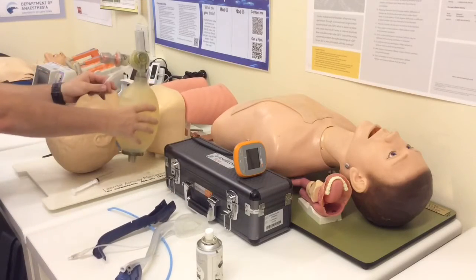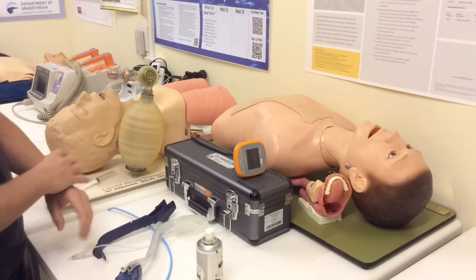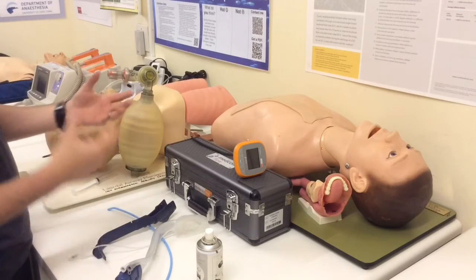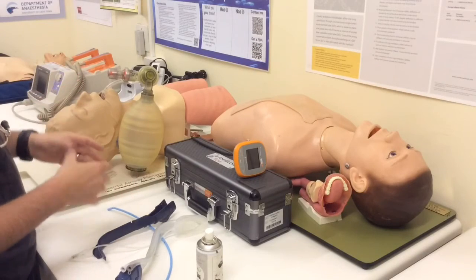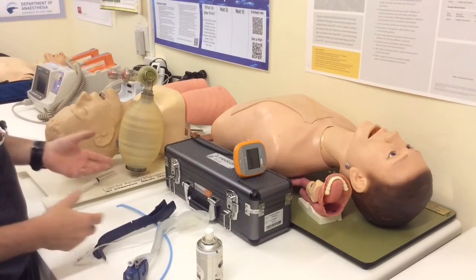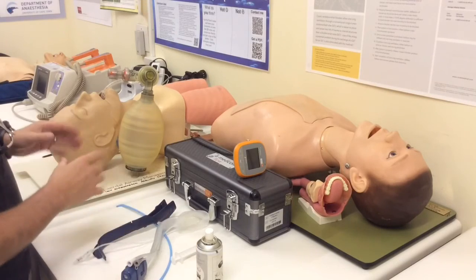Right, so a very interesting device. It allows you to secure the airway with a supraglottic airway, position it optimally under vision, intubate with next to no interruption in your ventilation and your oxygenation, and then you can remove the whole spiel quite quickly and easily. So, very interesting device.